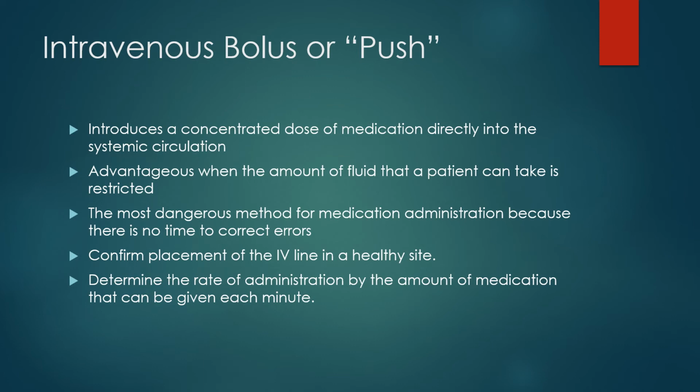There are advantages of this. The advantage is that it's not going to restrict the patient. I'm going to give that medication and then I'm going to walk away, and they're free and not attached to something all the time, to a pole or tubing all the time. So that's an advantage.